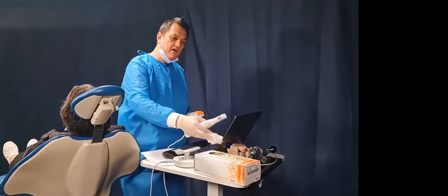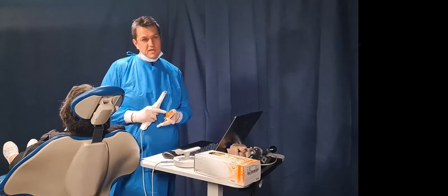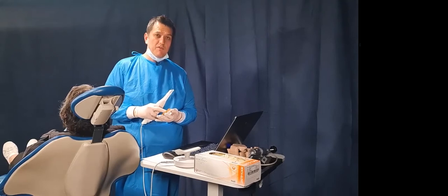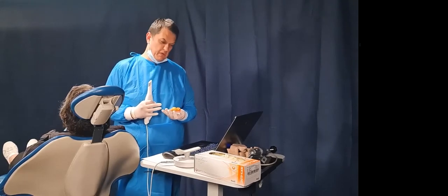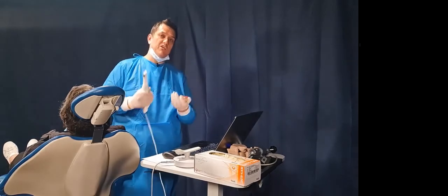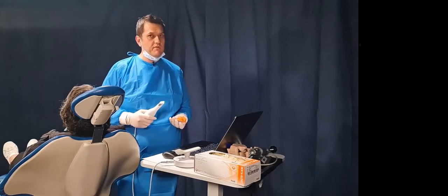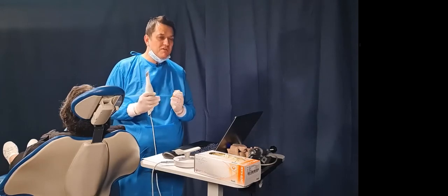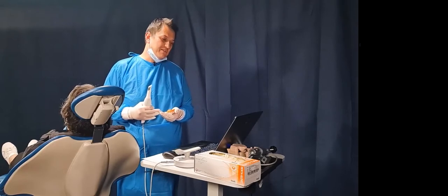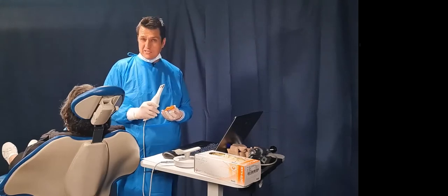Now, there are some tips. Again, we talked about you can't get them all. I'll tell you what you can't get sometimes with these. If you've got a very good lab, you can get around it though. Sometimes when the depth of the denture is extremely deep, I'm talking sort of 25 to 30 millimeters, or the flanges are wrapping back around, you will find it very difficult to get your scanner to take a picture of everything. You'll be able to get most, and if you can just get most of it, your lab, if they've got some good CAD experience, will actually be able to help you there and fill in those little gaps. But this is a great case for it, and I'm thankful that I have an easy case, and I'll show you some of the things that can go right or wrong.